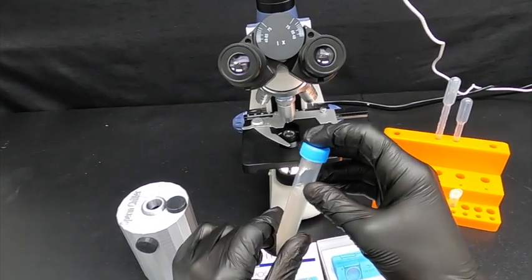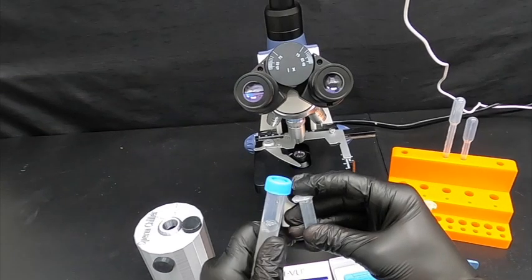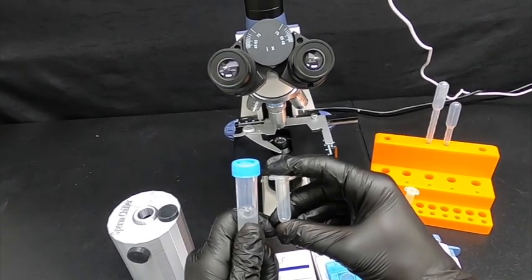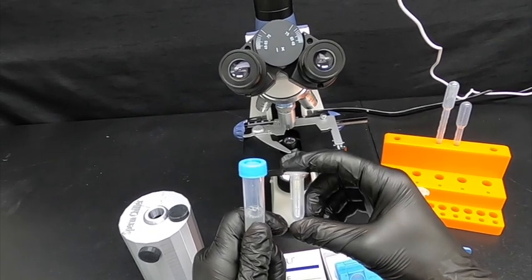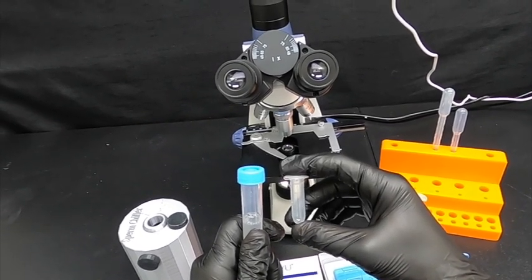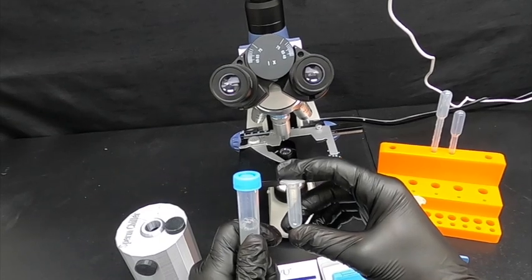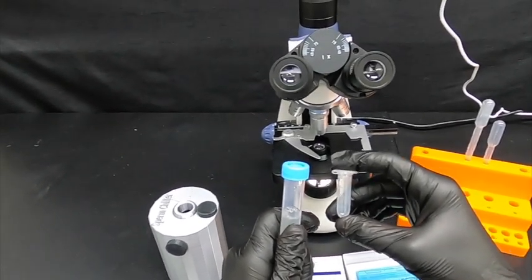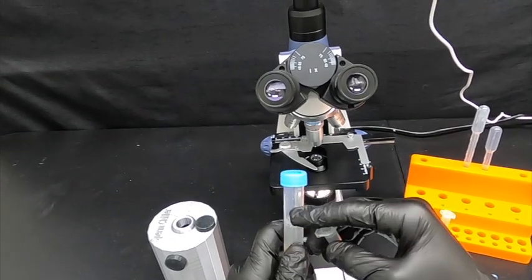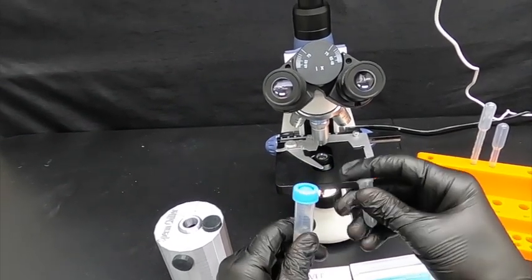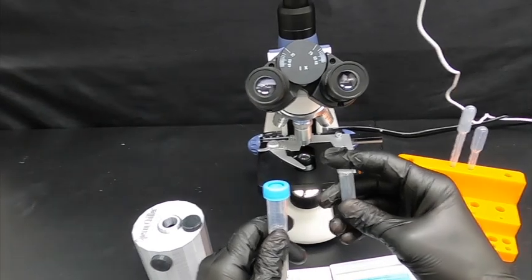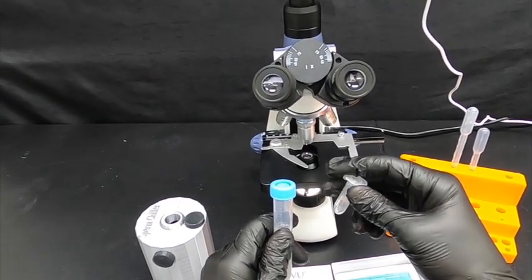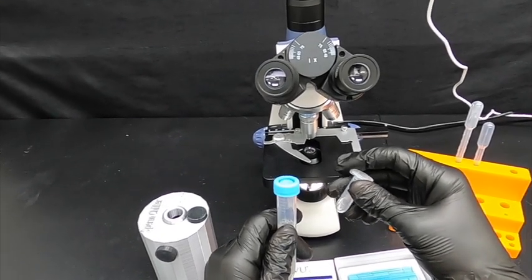What we're going to do here is transfer some of the sample into a different tube. We're killing off or harming the semen enough so they're not moving, so we can get a good concentration count. Again, you do not want to do this to your full sample, just a small portion. The count is most accurate when the sperm are not moving but staying in one place.